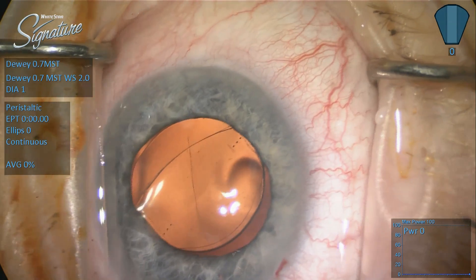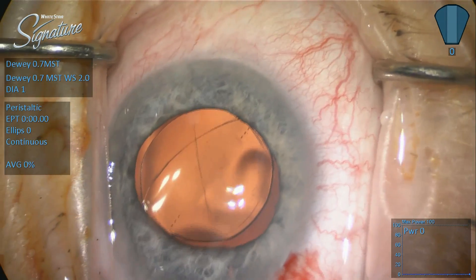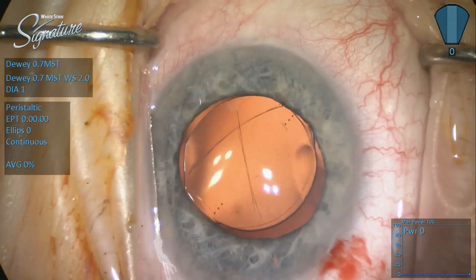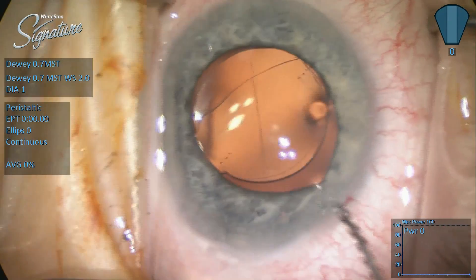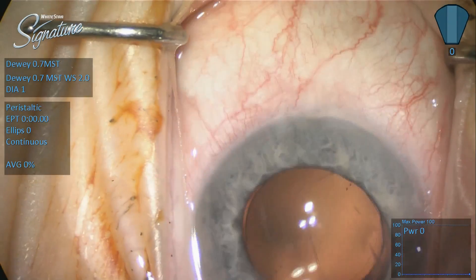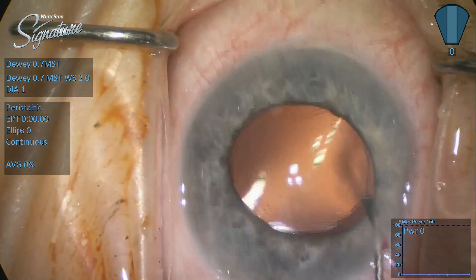So what we have here is a perfect situation for the reverse optic capture. Now, if I had a manual capsulorhexis that was slightly oval and not particularly centered properly, I would worry about whether I would achieve the optical alignment I was hoping for with the toric lens, or center the lens enough — even if I could get it aligned — that I wouldn't induce a significant amount of coma by having a decentered optic.